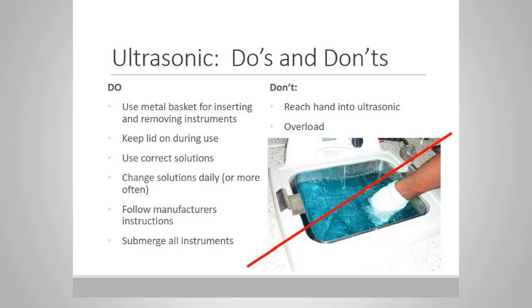Don't ever reach your hand into an ultrasonic and do not overload. If you overload, we cannot guarantee that the sound waves will bomb blast all surfaces of the instrument, and if you reach your hand into the ultrasonic, you can't see the sharp tips that may be within. Keep your hands out of the ultrasonic. Use that basket to insert and remove instruments each and every time.